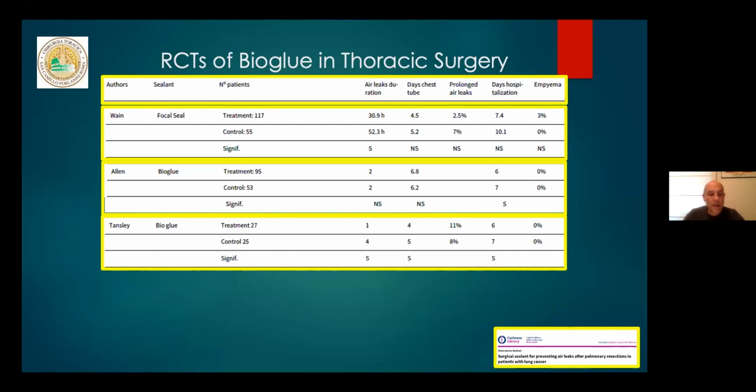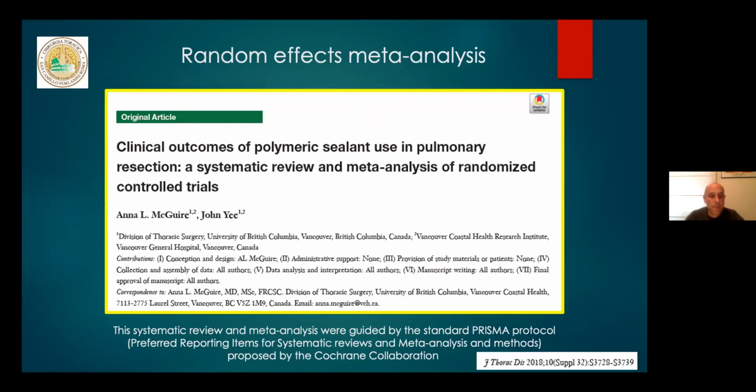First, patients with air leaks may be kept in the hospital for observation 1 more day after the chest tube is removed, whereas if the chest tube is kept just for high volume drainage, patients may be sent home immediately after removal of the chest tube. Second, more Heimlich valves were used in the sealant patients, 10%, than controls, 2%. And third, the measurement may not be sensitive enough because the authors measure chest tube duration by days and not by hours.